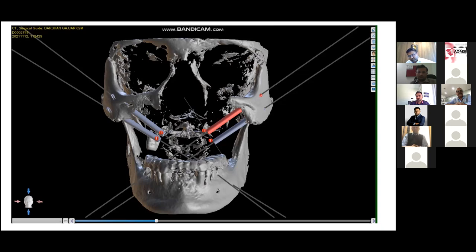I think Nehal has very well validated that point, that it still awaits the follow-up, because nobody has a long follow-up on the PSI implants, and we'll have to just wait and see what is going to happen with whatever has been implanted. Having said that, there is one disadvantage that I feel the PSI has, maybe of the weight that it would be subjecting the maxillary bone, which has just healed too, for doing the prosthesis and everything, and suspending it from the superficial part of the zygoma.